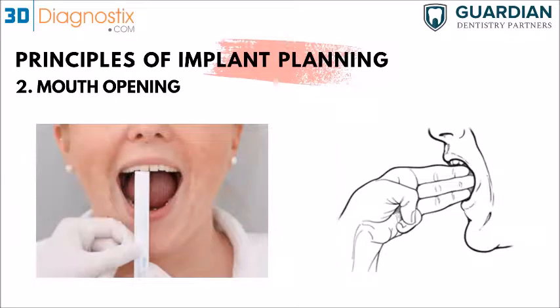And one of the most important things is mouth opening, and especially for implant sites far back in the premolars or the molar sites. Here is a picture of how to actually measure the patient's mouth opening. So either, of course, with a ruler on the left side or with a 3-finger technique on the right side. And you need to make sure that the patient can open up wide enough, at least 52 millimeters. And the reason why this is important is we've seen a lot of cases where we planned an implant in the first or second molar site, or sometimes the bicuspid, and patients have limited mouth opening.